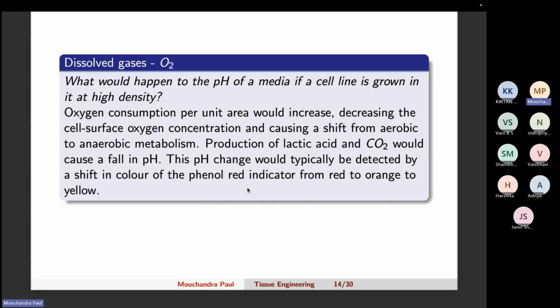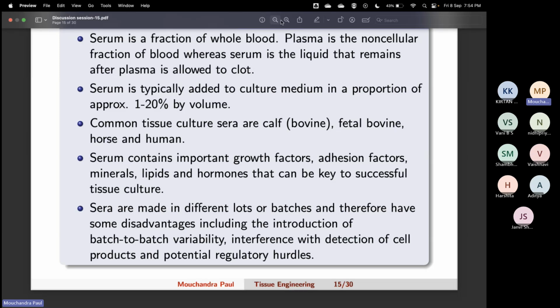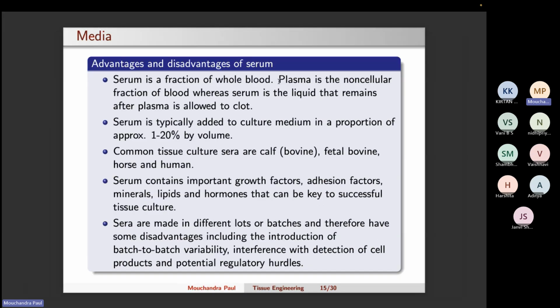So we always try to ensure that the cell doesn't get in contact with the media which is highly acidic. We change the media with fresh media in which the pH is 7.4. This kind of standardization one needs to do in order to maintain your cells in a healthy condition and reduce any variations that can happen over time.